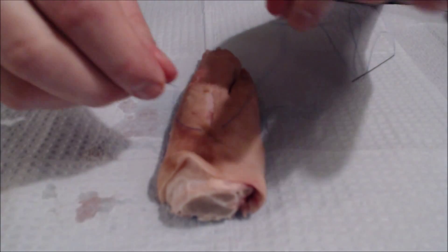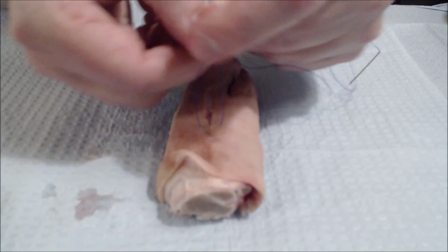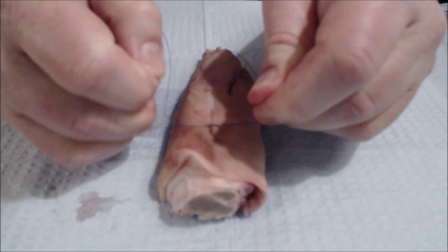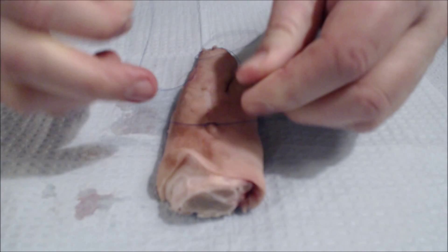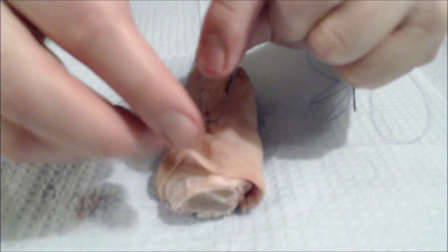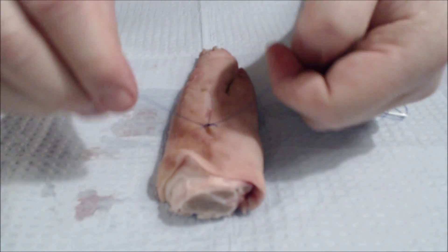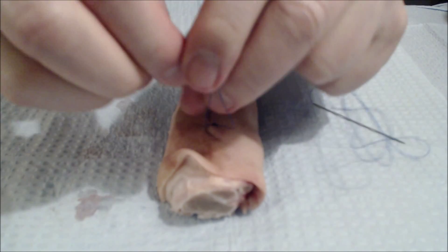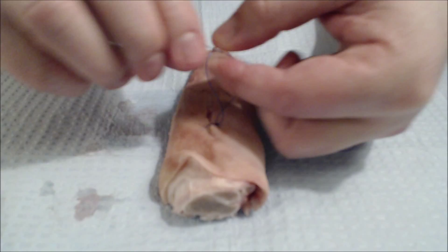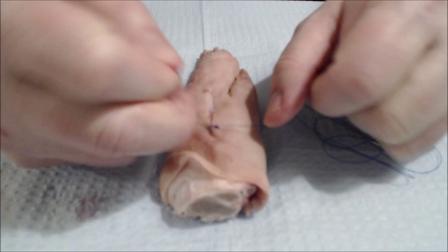As I do this, I'm going to try to get the knot to lay down flat if I can — then there's less likelihood that it'll come undone later. This isn't always possible though, and granny knots will work; they just require that you put in quite a few knots to ensure it doesn't come unraveled. Four knots is best.